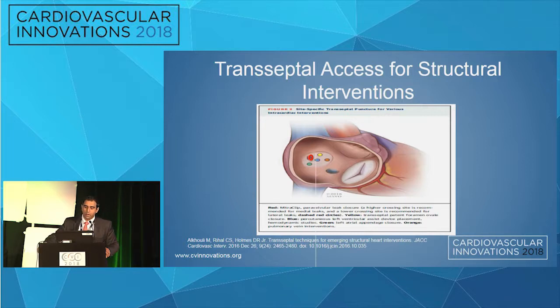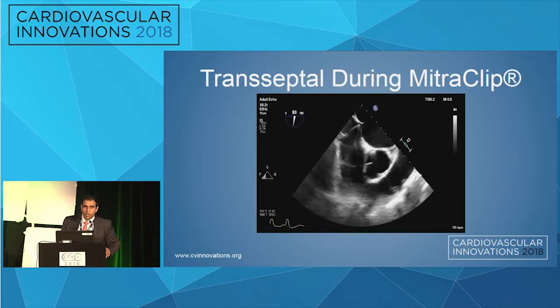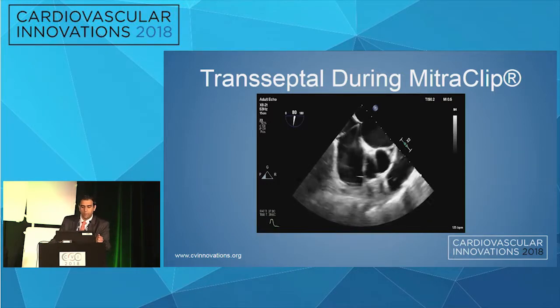And what I'll submit in this talk, and what I think many of us have thought about before, is how much do we have to hold ourselves to these locations? So I think this talk may be very relevant after some of the last couple of presentations we've seen this morning about transseptal access and how we are going to start seeing patients who return for repeat transseptal procedures. This is my transseptal puncture point using a Baylis system, which is what we use at our institution.